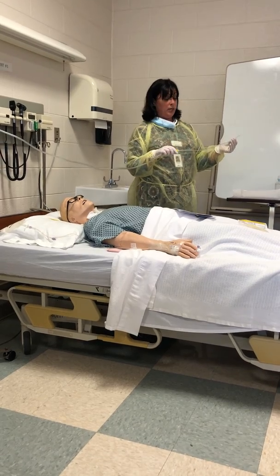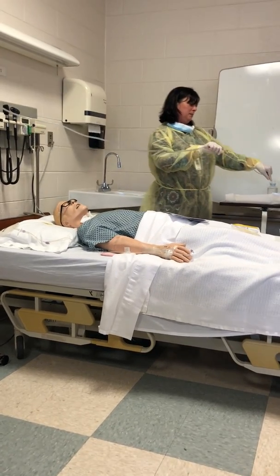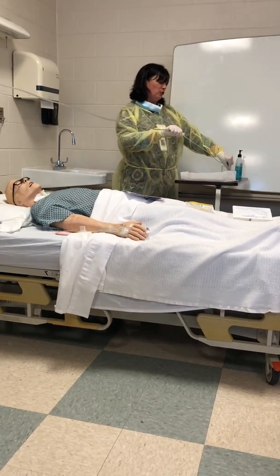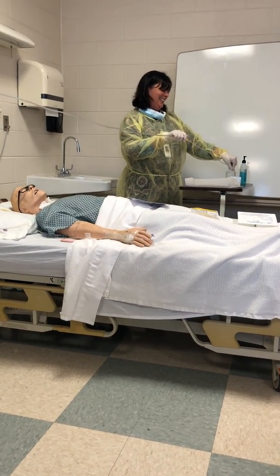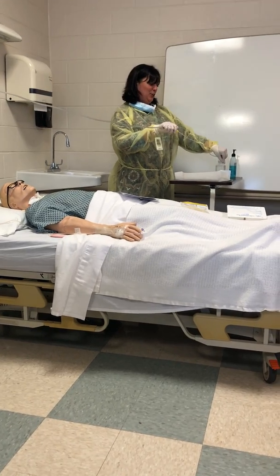Okay, so you need to lubricate the tip. Just the tip. You didn't help me out. Dennis, where's your noises? Sorry, I was just waiting for the peanut gallery to come in with the lubrication. So, lubricating the tip.